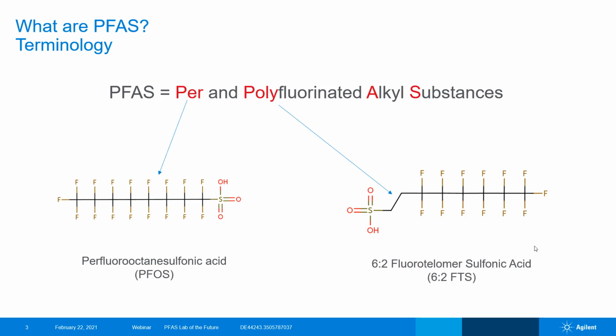So the first thing that's really important, and I'm sure many of you know if you're joining this webinar, is to understand what actually PFAS are. So PFAS stand for per and polyfluoroalkyl substances or per and polyfluorinated alkyl substances. The big difference being that a perfluorinated alkyl substance is one where in the alkyl chain, the carbons that are linked to the hydrogen, all the hydrogens are replaced by the fluorine atom.